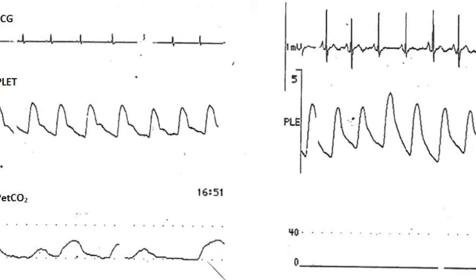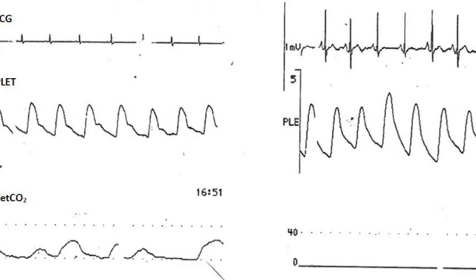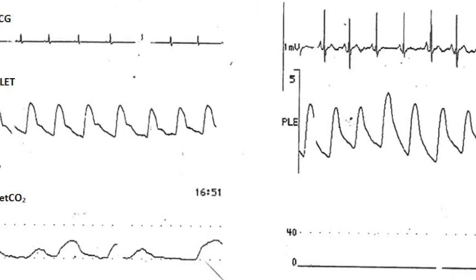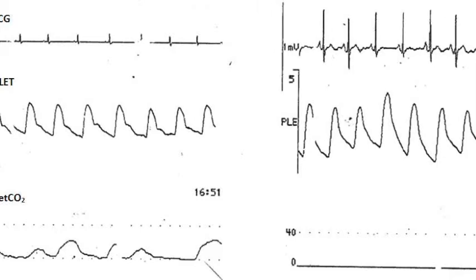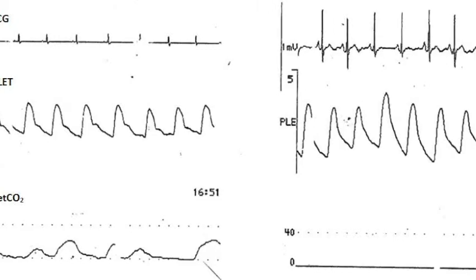Should we routinely decrease the sweep speeds of the plethysmographic waveform to better detect waveform variation? Probably. Since pulse oximetry is used anyway, might earlier recognition of airway obstruction, for example due to laryngospasm, while monitoring plethysmographic waveform variation, lead to better management of airway obstruction? Some monitors already can provide a plethysmographic variation index.